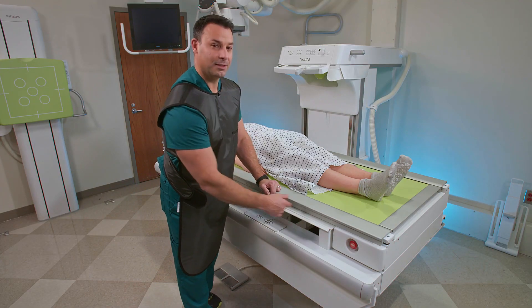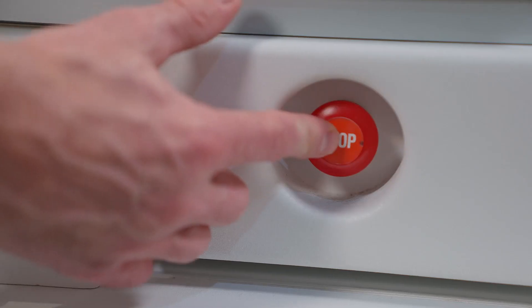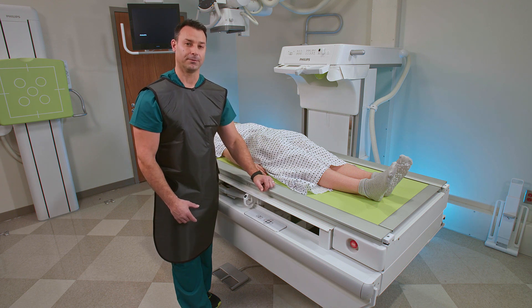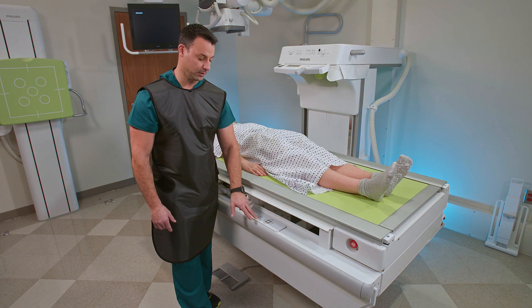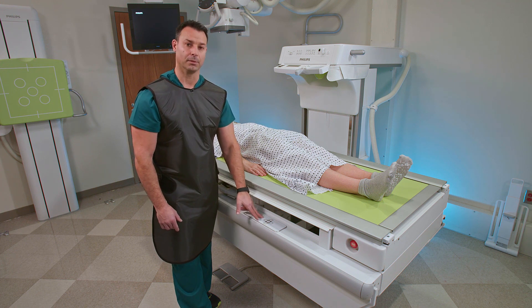I want to talk about the emergency stop. You can simply push in the stop button here, and it locks your tabletop from any movements. So if you have a patient over 550 pounds, you typically don't want to move your tabletop — you can lock it so there are no tabletop movements, and you also don't have the ability to angle your table.